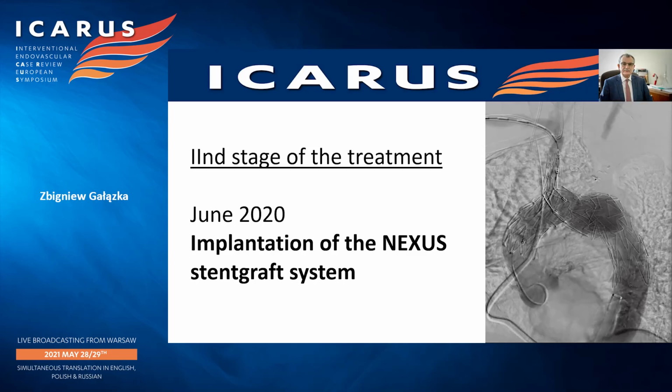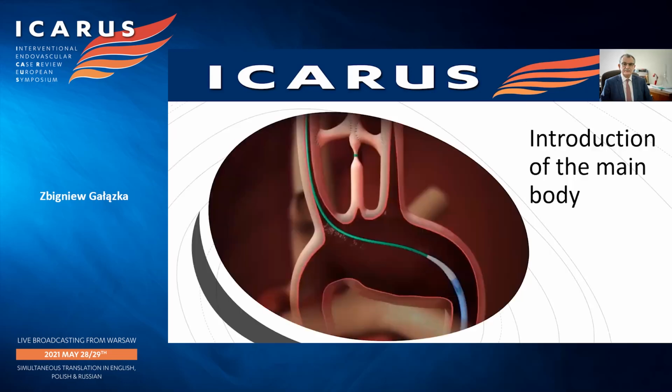The surgery was carried out under general anesthesia. The first step of the endovascular treatment was the introduction of the main body through the femoral arterial access.